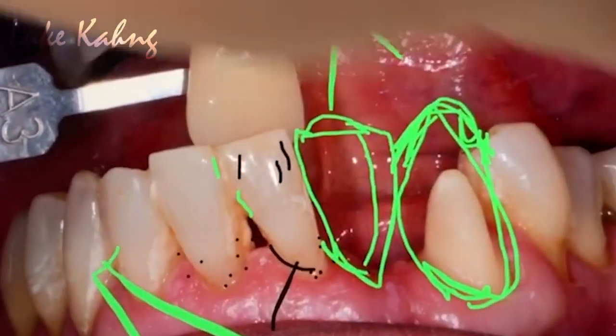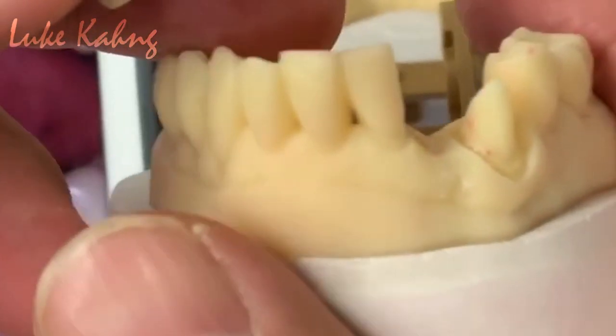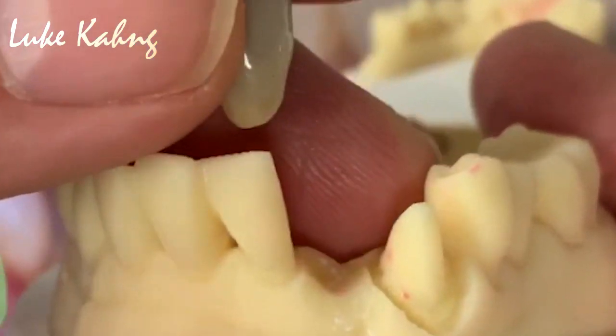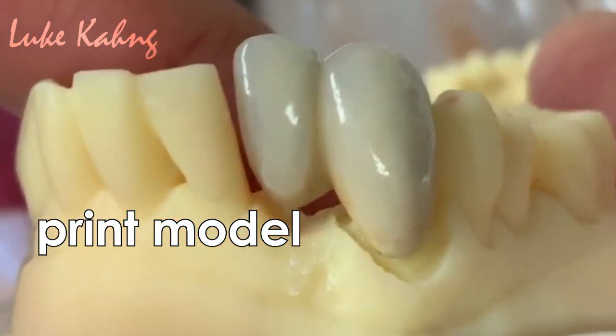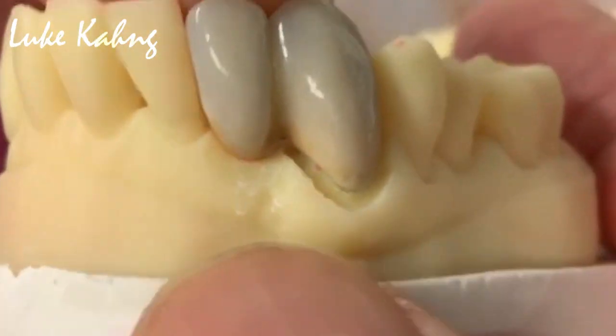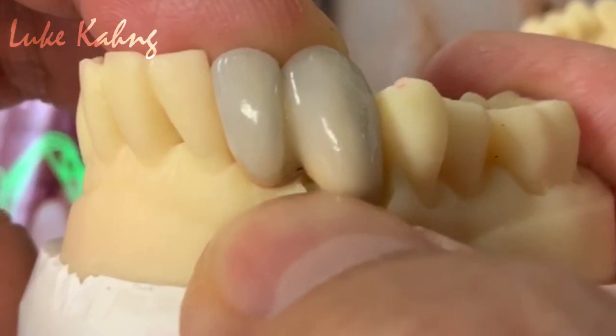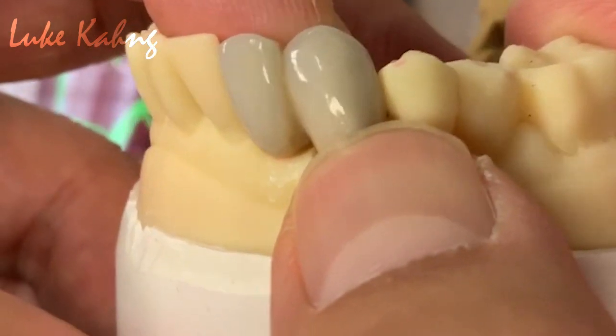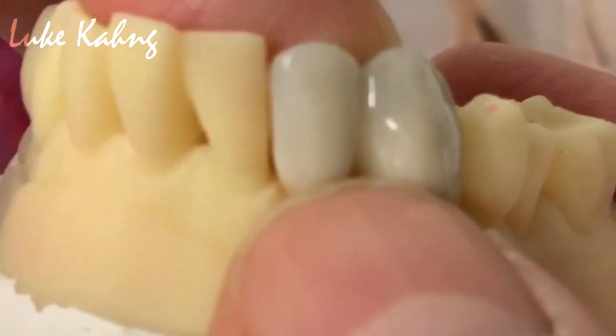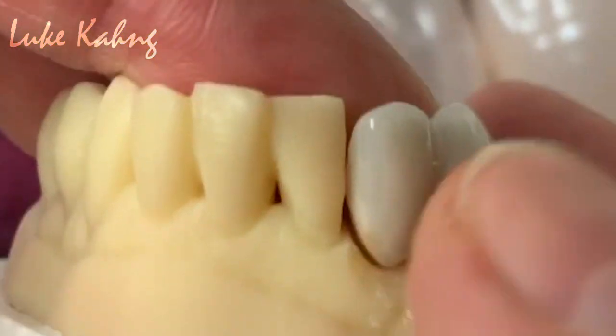So, the doctor sent me the 3D file. So we printed the model. And the porcelain fused to metal cantilever bridge is just finished. We just make the subtle color inside. You see it a little bit grayish, and a little bit of depth of the color. And then trying to mimic with the adjacent tooth.